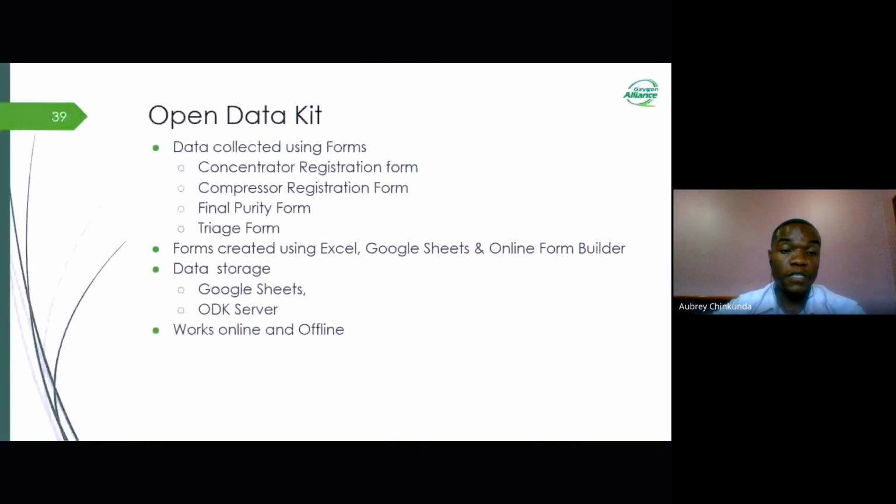Another amazing feature of ODK is that it allows you to work online and offline. If you're working offline in a facility that is in a remote area, you can do your data collection, and as long as after you get connected to the internet or Wi-Fi, all that data will be sent to the database. And most of this data is stored in a Google Sheet that you also have to configure once you download the app. You can also use the ODK server, but then you might need to pay for that. But if you want the free version, then you use the Google Sheets.